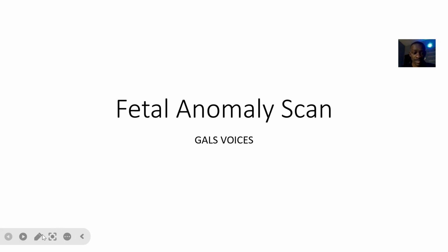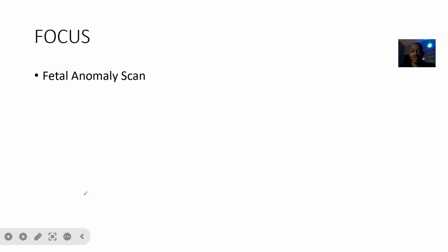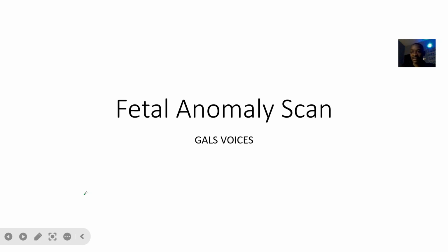Right, so we are looking at the next scan right here before us. This is what is known as a fetal anomaly scan. Anomaly is something that is not normal. They don't say fetal abnormal.